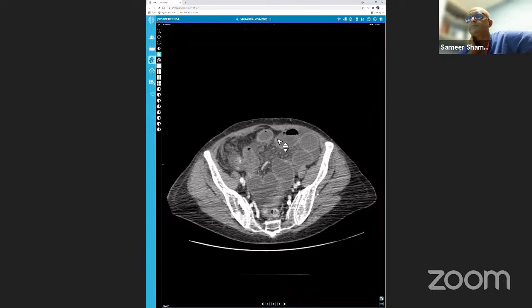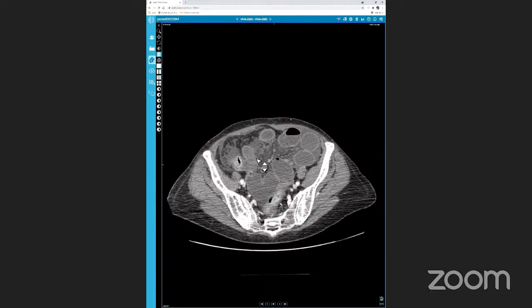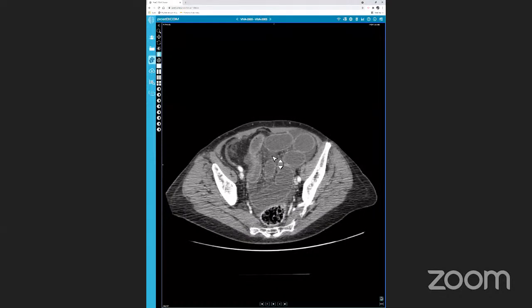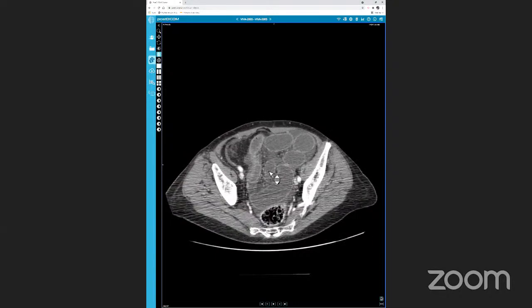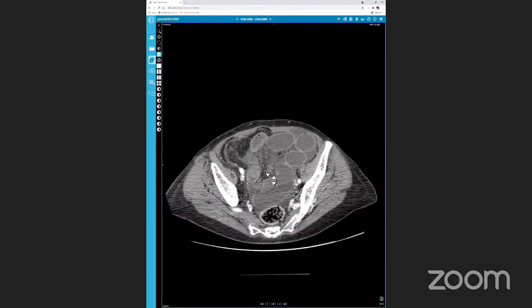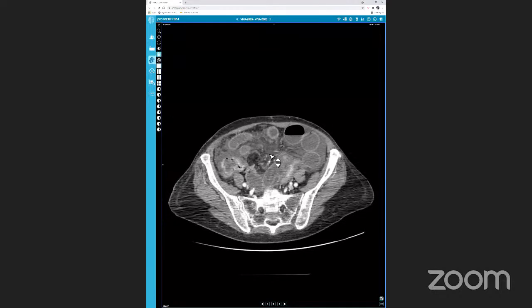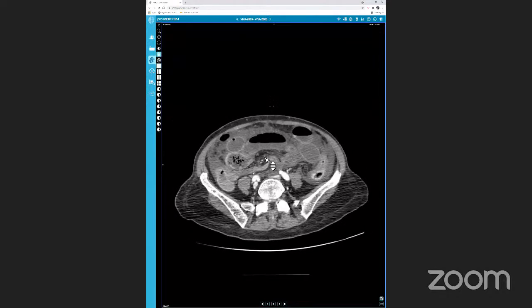Very good. So, what do you look for, bowel ischemia? So I look for any hypo or hyper enhancement of the bowel wall, any pneumatosis coli, any gas within the small bowel mesenteric veins, or any gas within the SMV or in the portal vein. So examining the small bowel loops here, it looks like there's normal enhancement. I'm just going to scroll back up to the liver and within the SMV to make sure there's no gas within the veins.